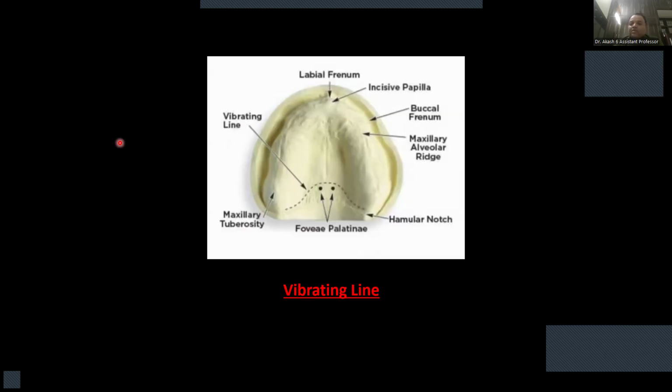So whenever you have an extended PPS, then the patient will come with a complaint of a problem in sucking or swallowing. They have a problem in swallowing or gag reflex frequently, as the gag reflex is particularly influenced by the glossopharyngeal nerve. So it is the most common entity.